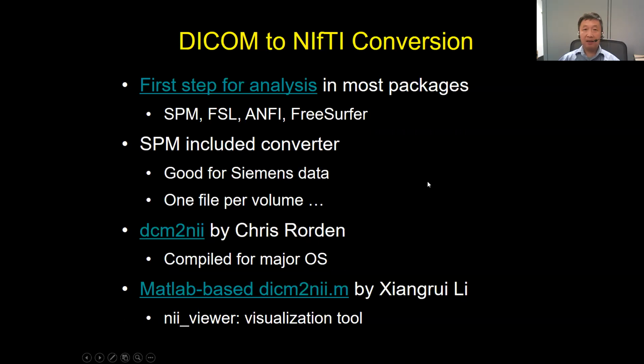file, because almost all scanners are designed for medical purposes, and they always save the images in Dicom format. Although Dicom is universal, it's too complicated for our purpose. That's why in the scientific area, people prefer the simpler NIfTI format. So far, the popular SPM, FSL, AFNI all use NIfTI format.